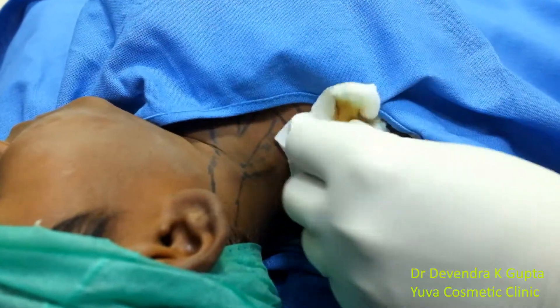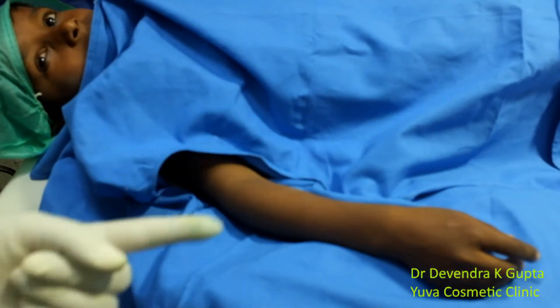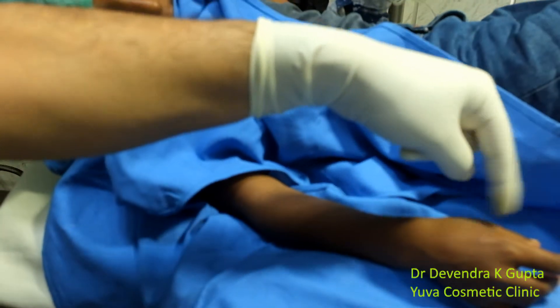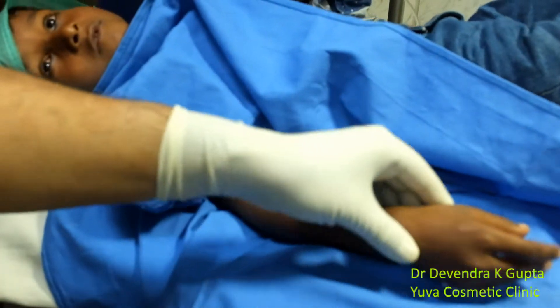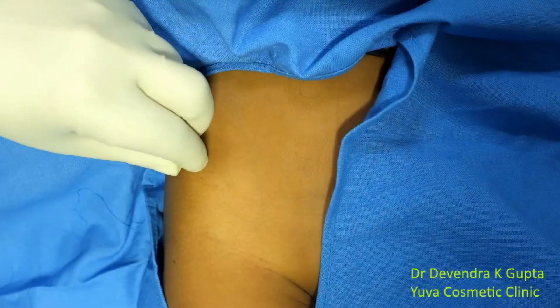You can see the prominent veins because of the enhanced vascularity, and the patient is unable to lift the arm. The block is complete — it is a perfect block. This is a compartment block in this 7-year-old child.